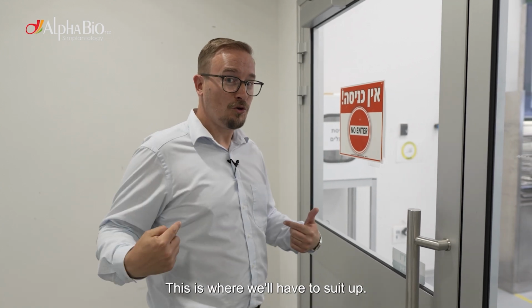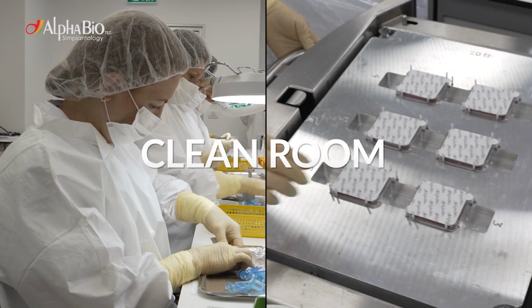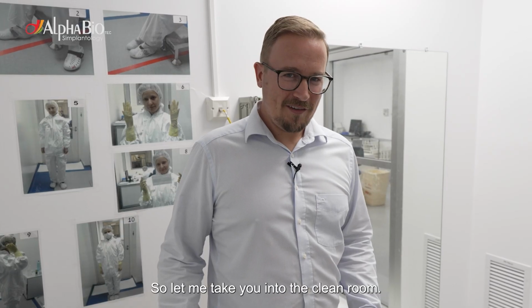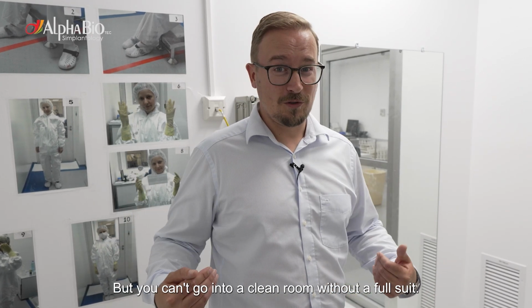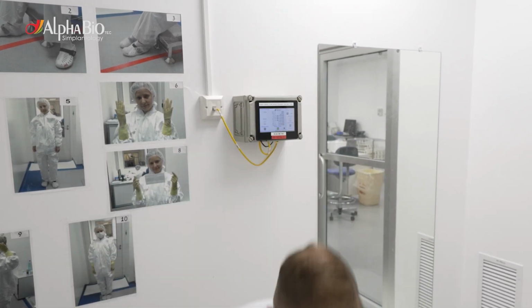This is where we'll have to suit up. So let me take you into the clean room. But you can't go into a clean room without a full suit. So let's suit up first.